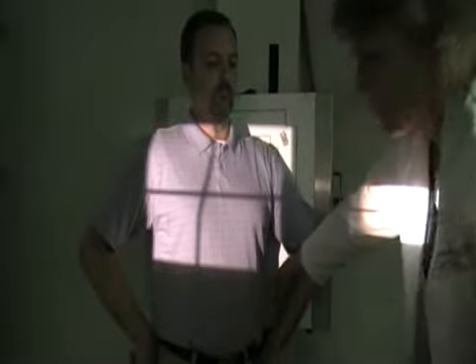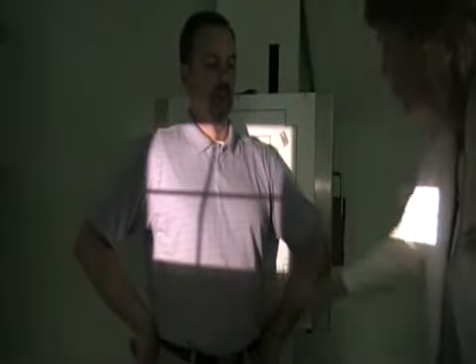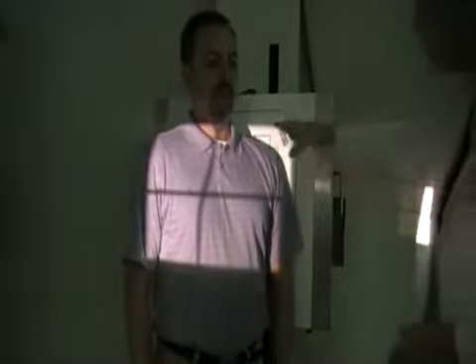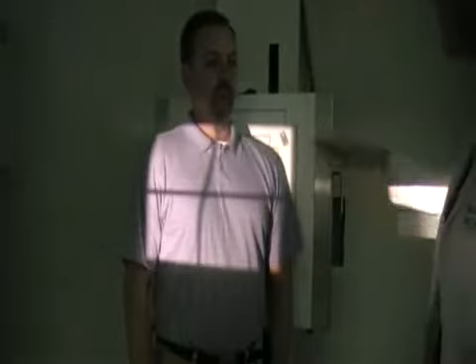You can see it beyond this left border of the chest, and you can see the light field go beyond the right border of the chest. So you want to double check and make sure that it does traverse across the chest area. You also want to check that you see light field 1.5 to 2 inches above the relaxed shoulders.